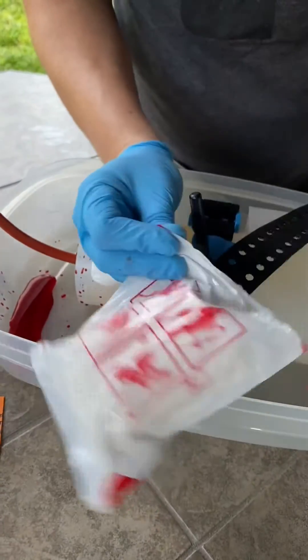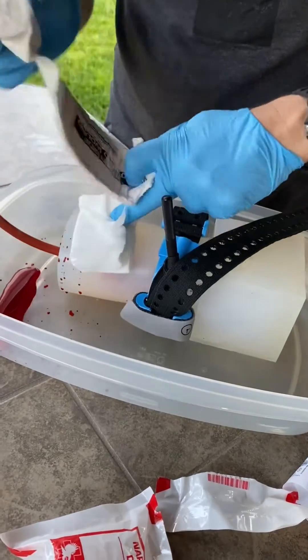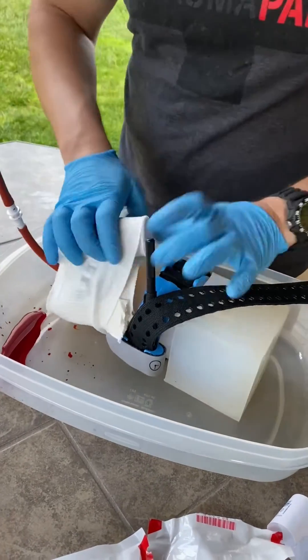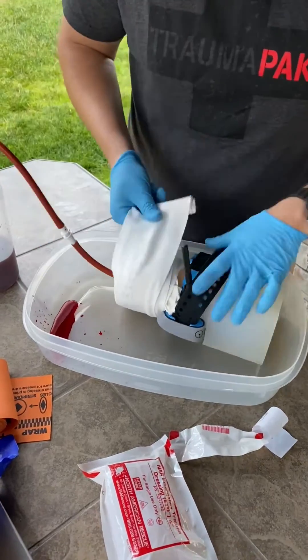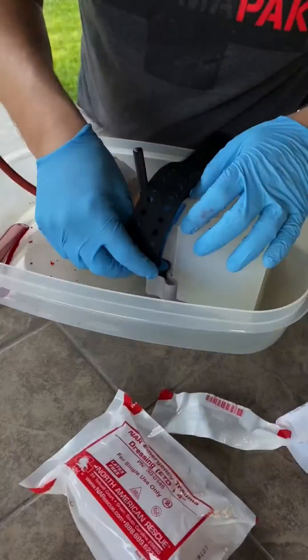I put direct pressure with the remaining gauze on top and I'm going to wrap it. In this case I'm using a North American Rescue pressure dressing, but you can also use any type of pressure wrap or other bandage. In trauma kits you will often see a pressure wrap used because there's no need for the padding since the wound is already packed, but either way that will work as long as you get pressure on it.